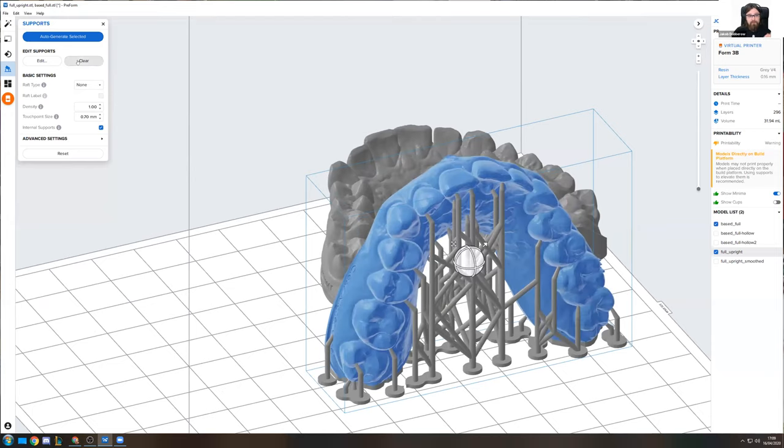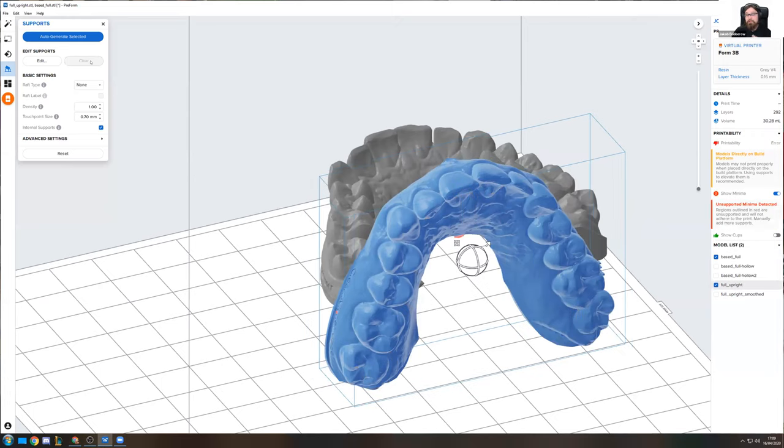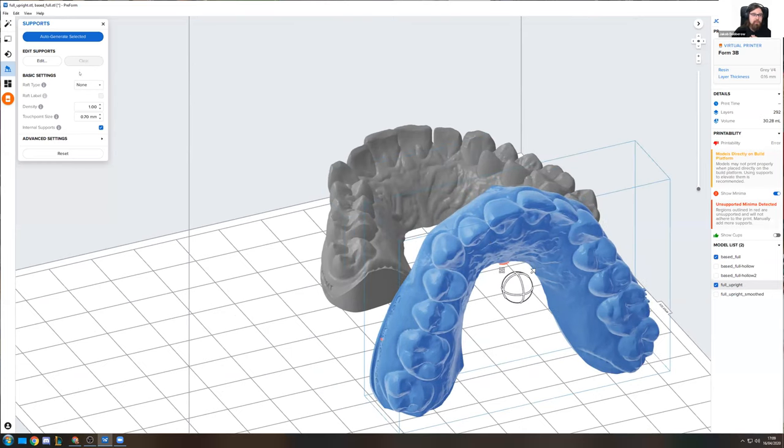So an alternative to just using the automatic functions with everything on stock standard is that you can actually play around with these values. Or the way I actually like to do it is to not use this automatic function at all. You can use it as a start, and that's just fine. But me being a little bit on the lazy side, I like to actually just spend a minute extra.